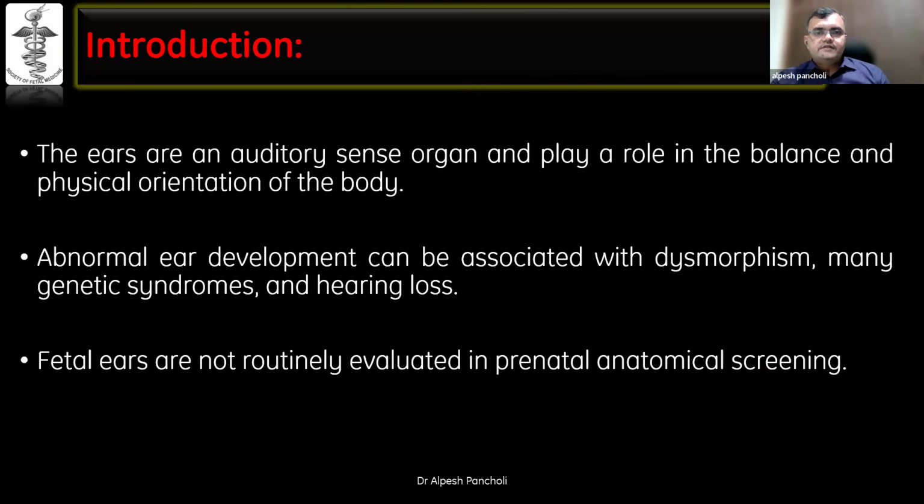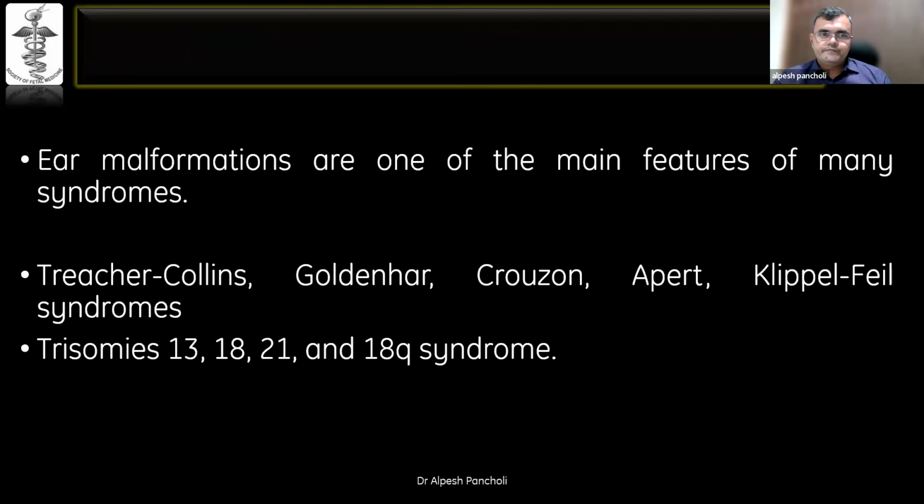So the ears are auditory sense organs and they play a role in hearing as well as in the balance and physical orientation of the body. Abnormal ear development can be associated with facial dysmorphism, many genetic syndromes, and hearing loss. But fetal ears are not routinely evaluated in prenatal anatomical screening.